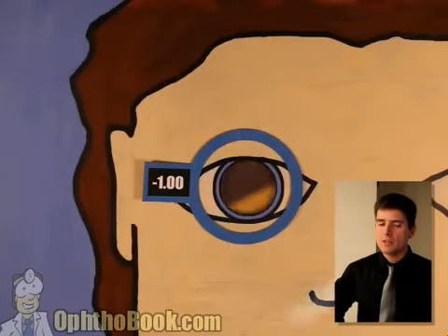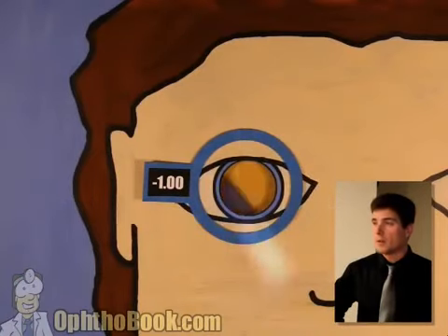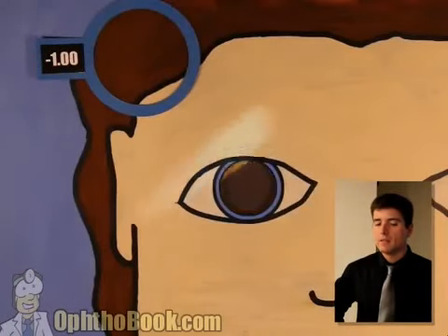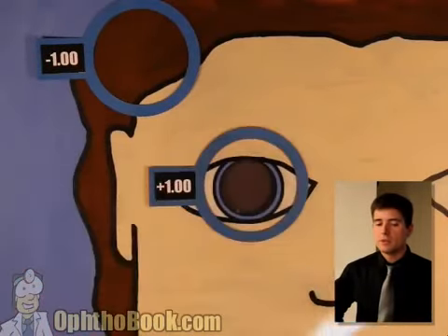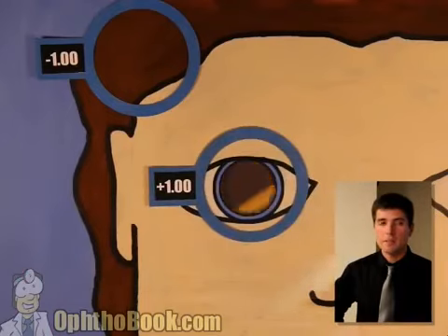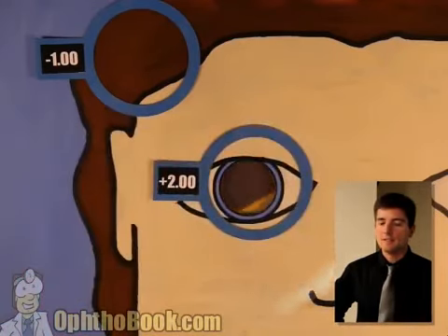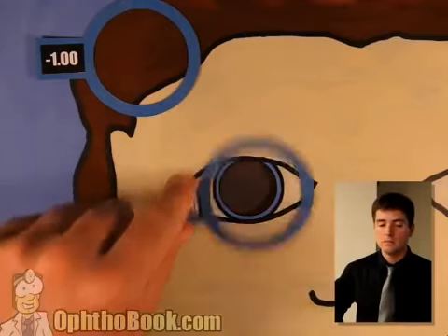Not quite there yet. This direction. We've got it this way. Let's set our lens aside. We're going to get confused and keep going the other way. Plano. No, not quite there yet. +1. Oh, they've got a fair amount of astigmatism. Not quite there yet. +2. Let's try it. Oh, no. Man, this is a high astigmatism.